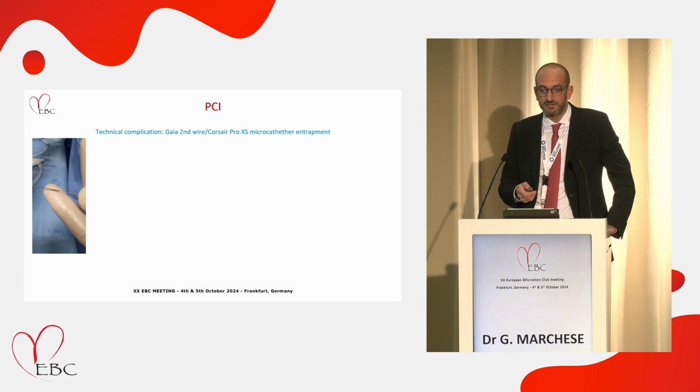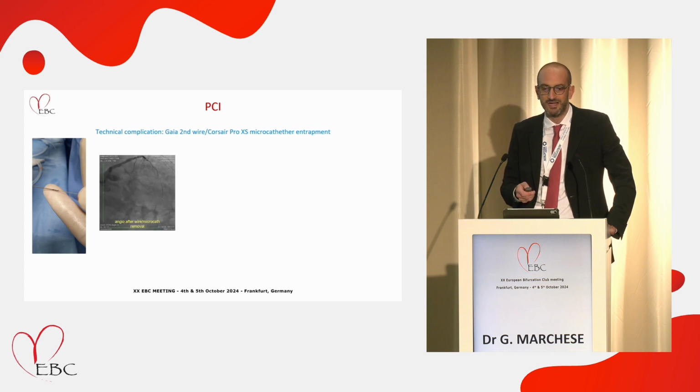We have something like a fusion between the wire and the microcatheter. So this entrapment was impossible for us to keep out one of the two devices. So we need to take both like a unit out from the patient. So we were in this situation after the wire microcatheter removal.